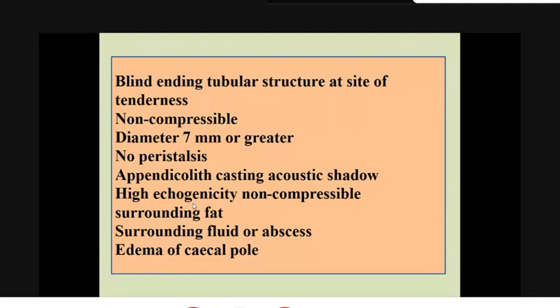So we use the graded compression technique for diagnosis of the ultrasound using a probe of at least 7 megahertz. وين أخلي البروب؟ أخلي البروب at the area of maximum tenderness in the right iliac fossa. يعني أسأل المريض وين أكثر مكان جاي أذيك بالرايت iliac fossa، يشير لي عليه، أخلي البروب عليه بالتحديد. طبعا أنا أفحص المنطقة كلها لكن أركز الفحص مالتي على الاريا of maximum tenderness.